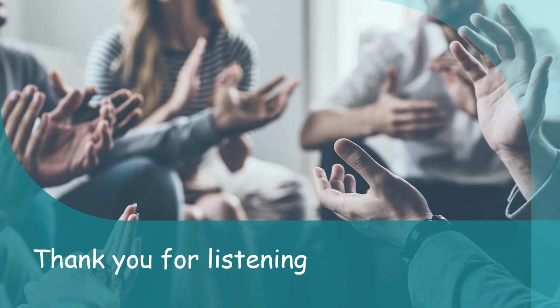So please don't feel pressured that you have to know how to make specific phrases or know how to navigate it. It's okay to make mistakes. Have a little look at the user guide and take a look at the YouTube channel and try and familiarise yourself with things. And you're welcome to comment or share any emails that you want support with.